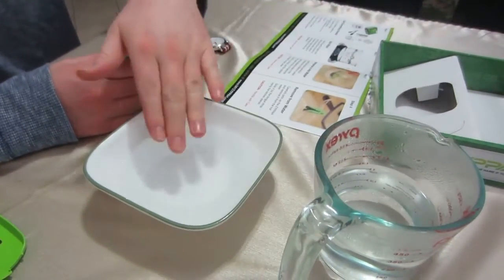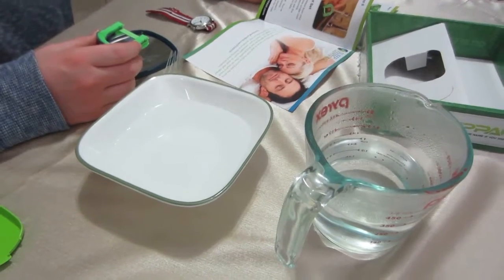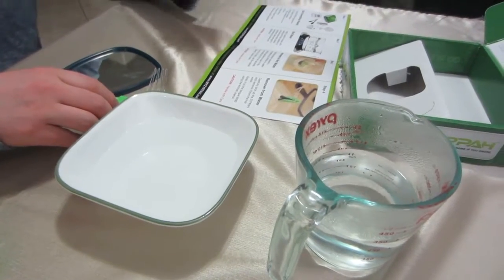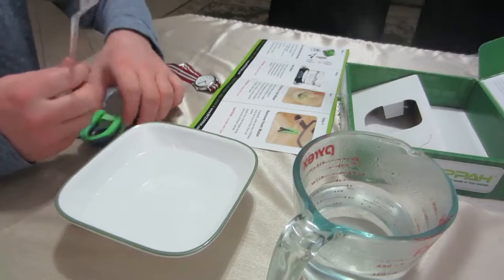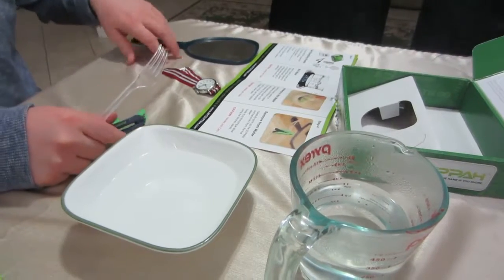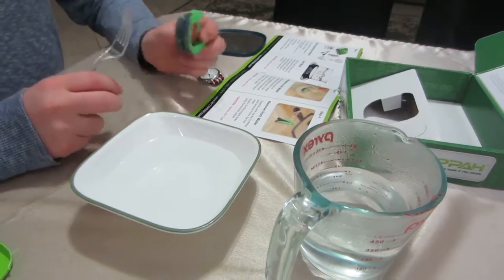We have the hot water here and cold water here. Officially the instructions say that after it's in the hot water I'm supposed to put it under a running faucet, but this should be fine. I have my stopwatch, a utensil here to hold it in the hot water as it tends to float, and a mirror so I can watch and make sure I do it correctly.